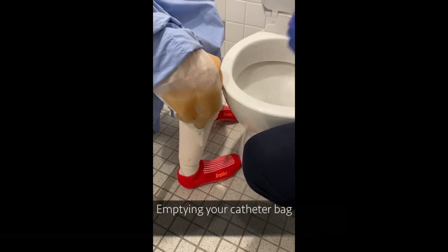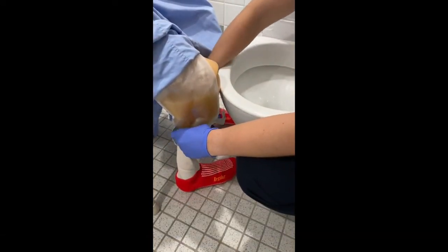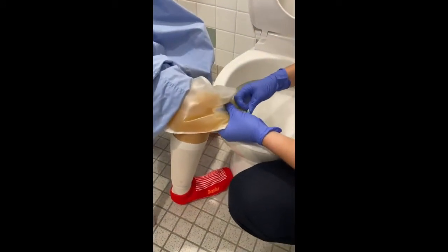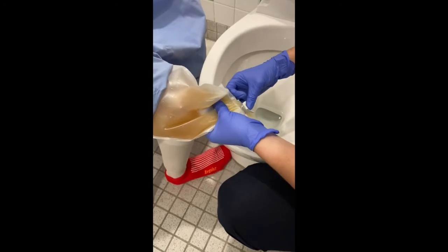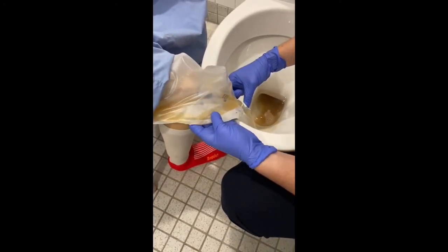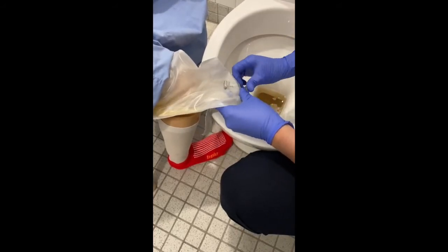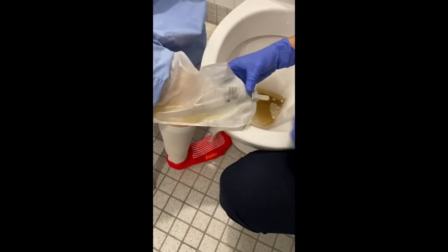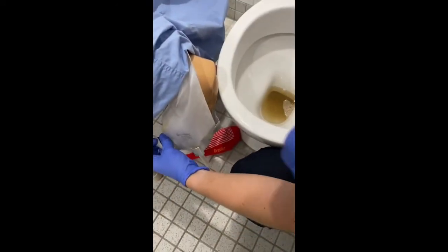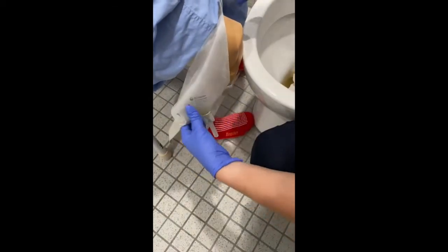To empty the catheter, it is usually found easiest to undo the bottom velcro strap, hold the catheter over the toilet and empty into the toilet as shown. If you have any back problems, sit down on the toilet and empty your catheter into a container, such as an old milk carton or bottle, to take the pressure off bending over and allow you to remain steady when emptying the bag.